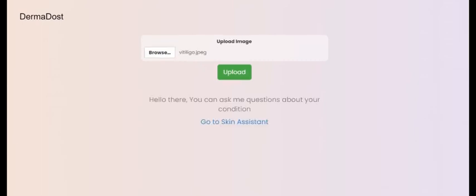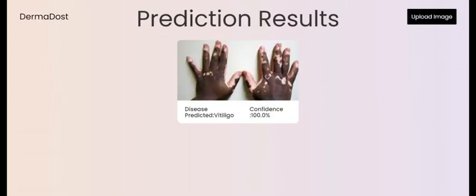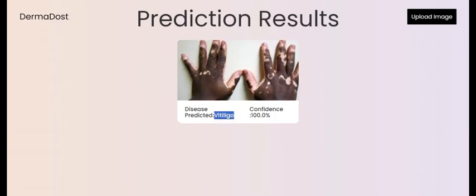In this case I'm using the image of a person who is suffering from vitiligo. Once I upload it and wait for the results — as you can see, we got the correct result, which is vitiligo, and the confidence level is 100 percent. This means the result is very trustworthy.